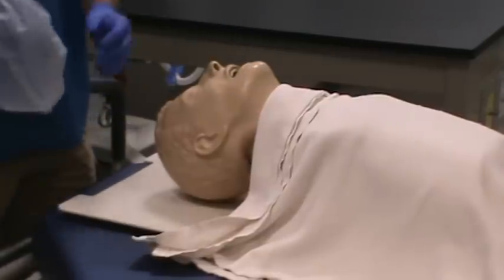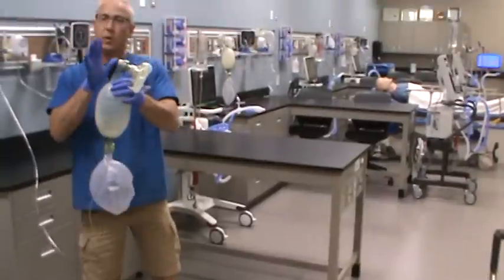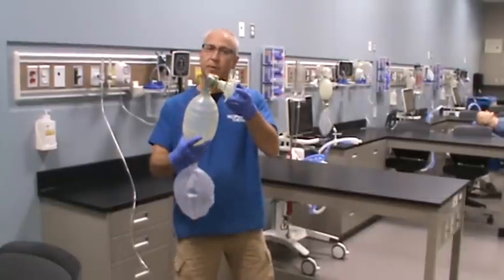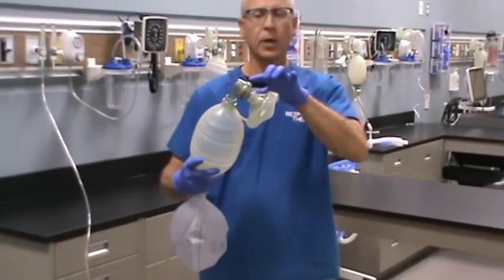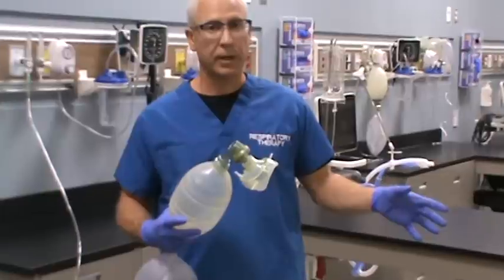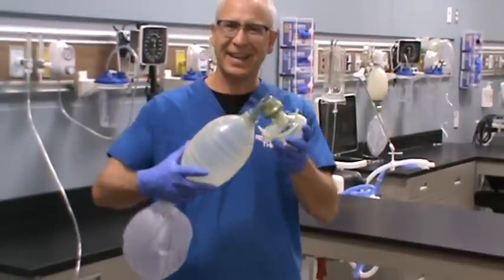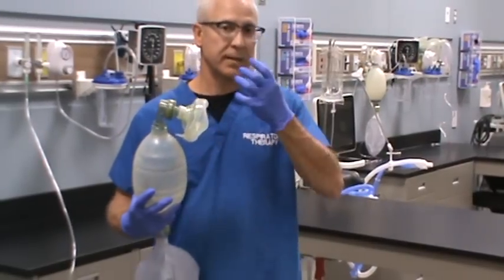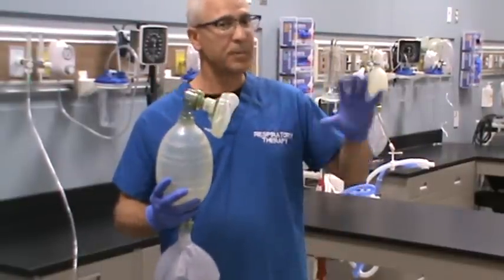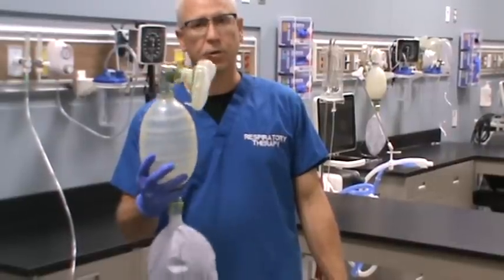One important thing to note: if you're bagging a patient that doesn't have an artificial airway in place with a cuff, never use PEEP. There is no PEEP valve on my device here because I was manually ventilating a patient without an artificial airway securing the lower airway. If you use a PEEP valve without airway protection, the same pressure applied to the upper airway and lungs would also be applied to the patient's esophagus and stomach, potentially ventilating the stomach.